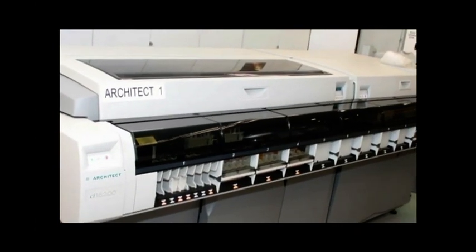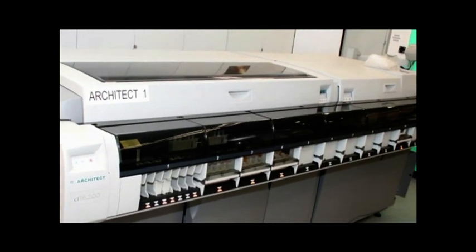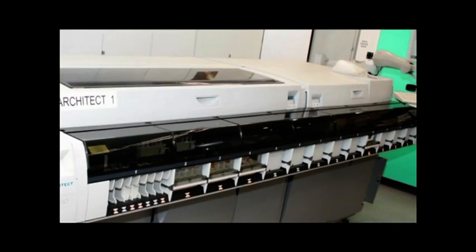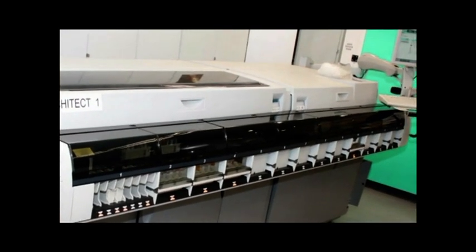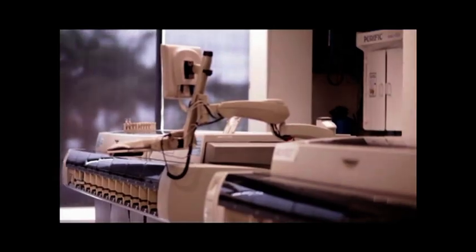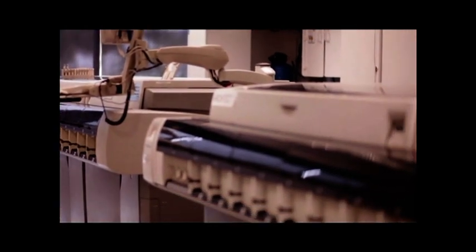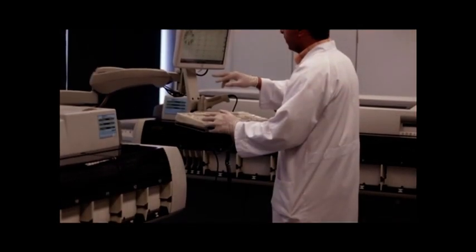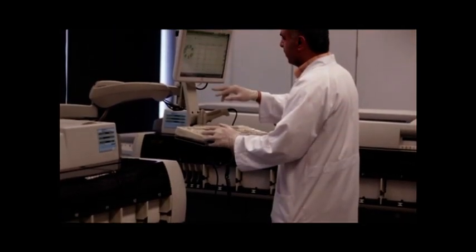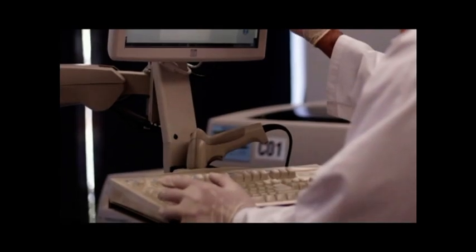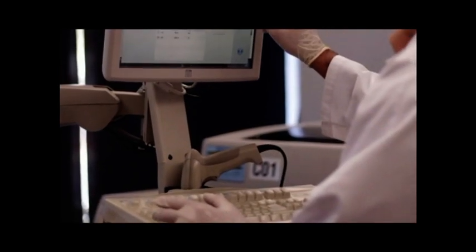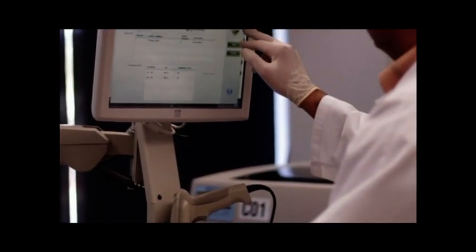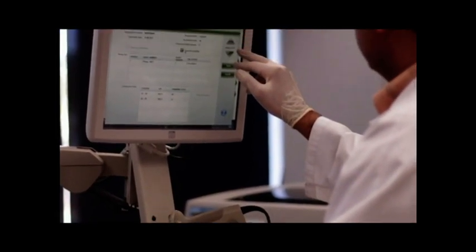The architect C16000 is used in the Biochemistry department. It is capable of performing 1800 clinical tests per hour. Robotic sample handler technology eliminates bottlenecks and prioritizes urgent requests.